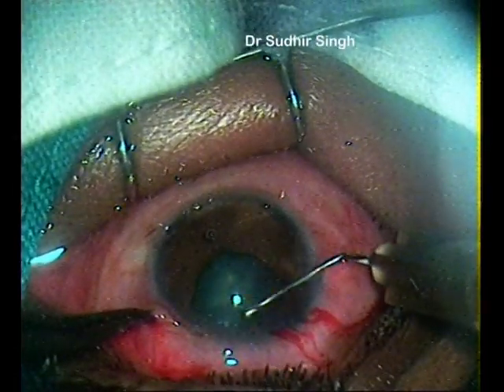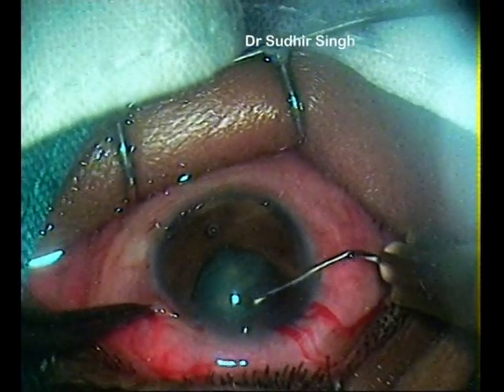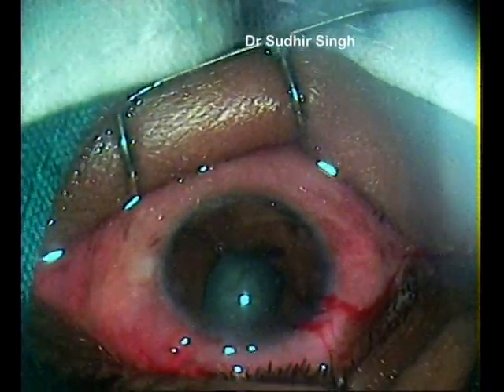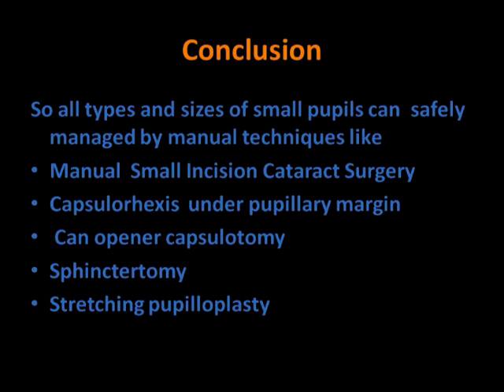This case is completed successfully by clear corneal phacoemulsification with foldable IOL. In conclusion, all types and sizes of small pupils can be safely managed by manual techniques such as manual small incision cataract surgery, capsulorhexis under pupillary margin, can opener capsulotomy, sphincterotomy, stretching, and pupilloplasty.